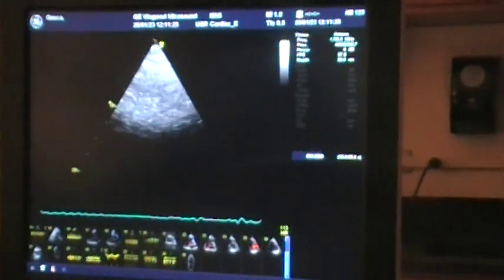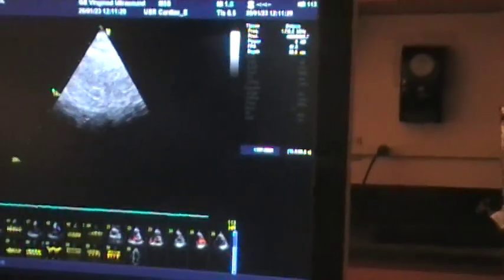Okay, so that is subcostal. Do you guys do suprasternal where you're at? Okay, so we'll do suprasternal because I do want you to know it. Either way, suprasternal is very important for patients with aortic stenosis, that type of thing. It should be good. All right, so your reference point or your notch is going to be at 1 o'clock. So not straight up to their chin, but just at 1 o'clock compared to their chin. You're going to be just in the little notch right there above their clavicles.